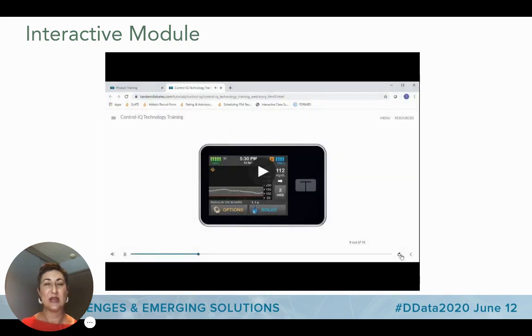All right. So this example is similar to training tools that you may have seen in other industries, such as an online traffic school or even doing some HR training modules. You actively have to tap on things in order to advance to the next item. So here, learning occurs by using the pump on screen.